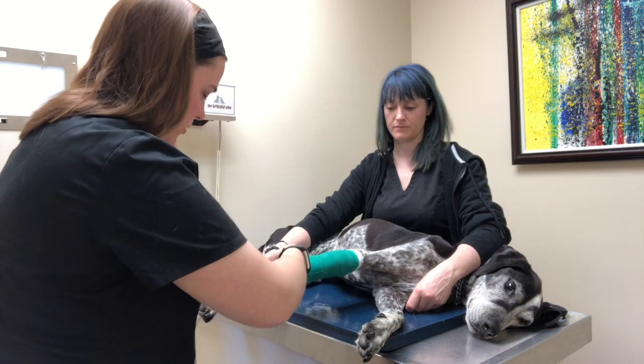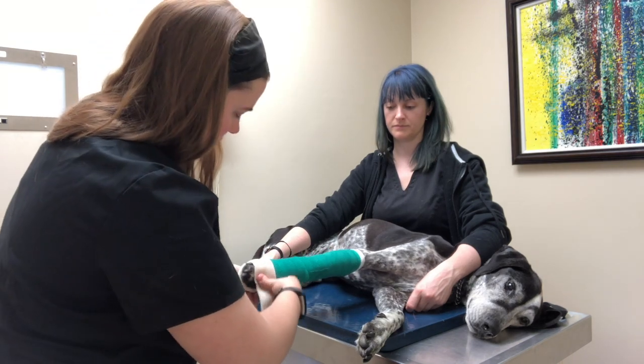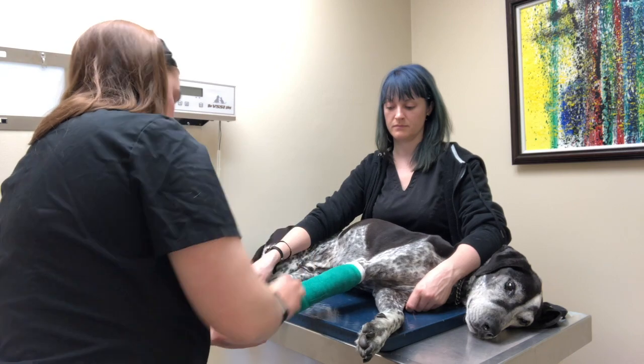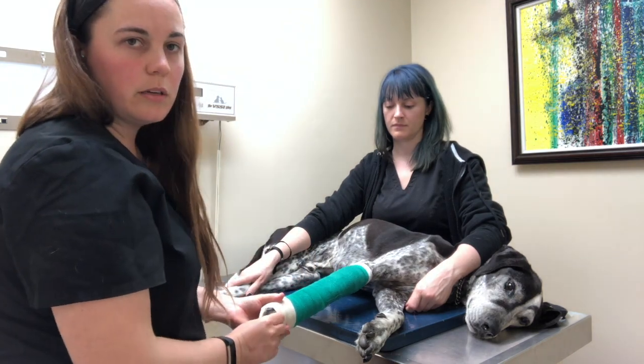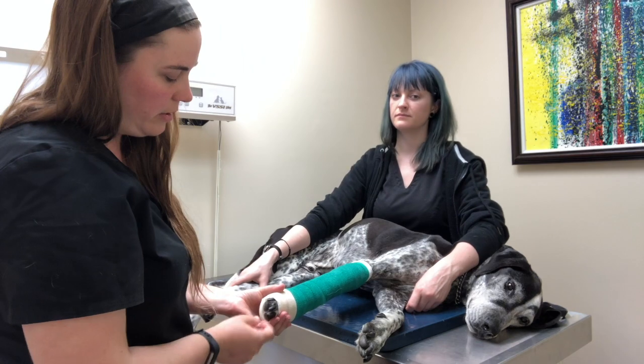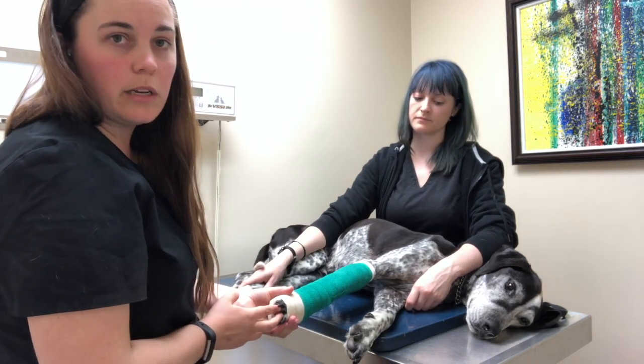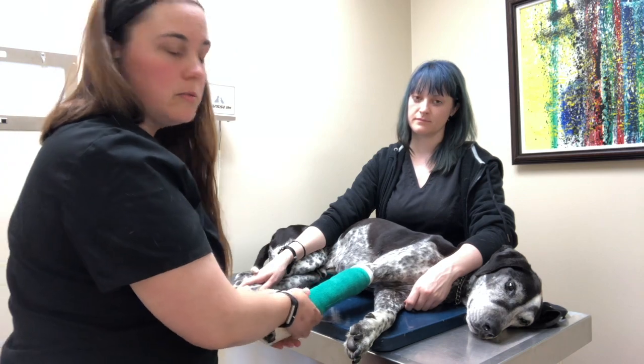Still leaving your toes out, the third and fourth toes. That way your owner can check for any swelling. You want to let your client know that to look for swelling, see if the toes are separated, which means that the bandage could be too tight.